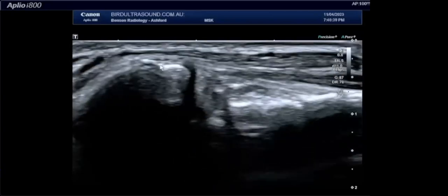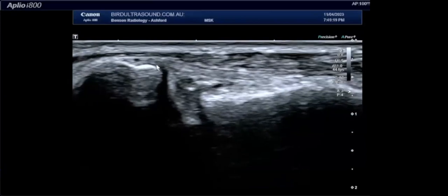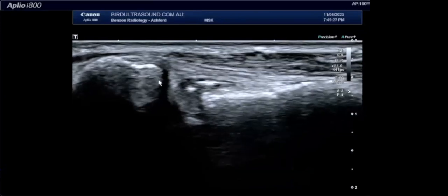It's really this proximal end where the avulsion fractures are very, very common. You will have already thought about the Chopart line when you're having a look at the dorsal talonavicular ligament, but it's an easy thing to remind yourself about the Chopart line.